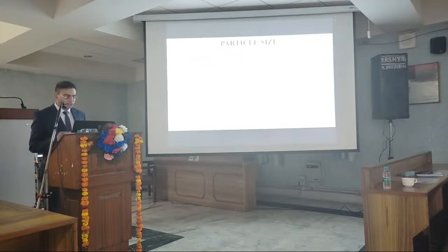If we choose a smaller particle size, there will be a faster rate of migration of the radiocolloid from the site of injection to the sentinel lymph node, but simultaneously there will be lesser retention time in the sentinel lymph node. So we will get a very small window of imaging the lymph node. If we use larger particles, the migration to the lymph node will be slower, but the retention time will be higher, so you will get a good enough amount of time for imaging. So we have to get a balance between the two paradigms.